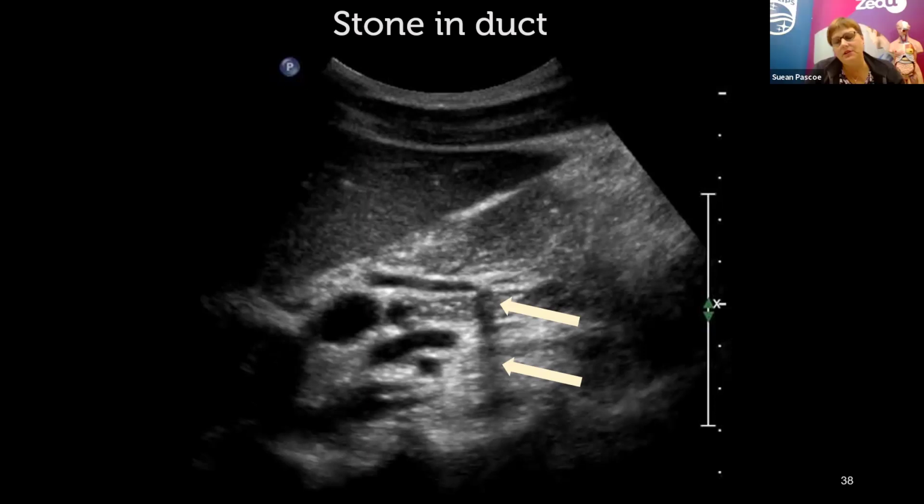Yeah. Actually, that's a good point you raised, Jenny. When we first started teaching gallbladder, my method behind the madness was, let's show you how to do a measurement of the bile duct, because you're going to ask. But I personally don't think that this is a point of care application. I know it's there in the CCPU guidelines, but it's actually really quite difficult to do. Especially in some of your patients who are obese and can't hold their breath for you. Learning how to measure the bile duct is one of the trickiest things we do in the abdomen, and it takes lots and lots of practice.